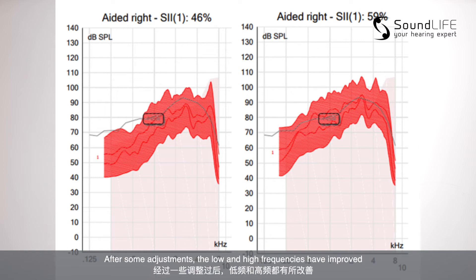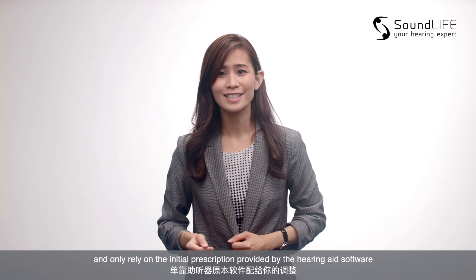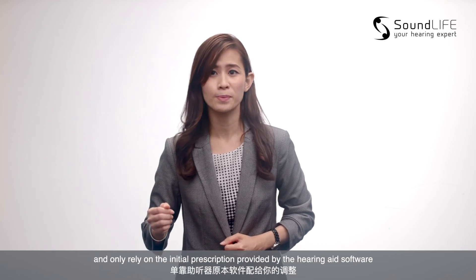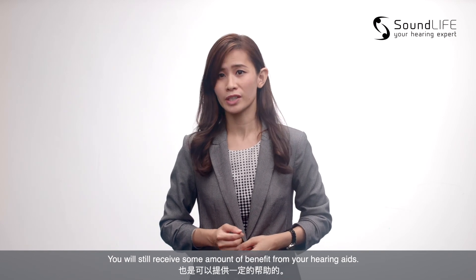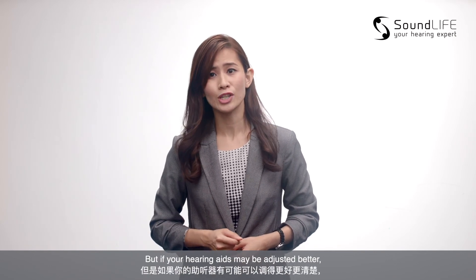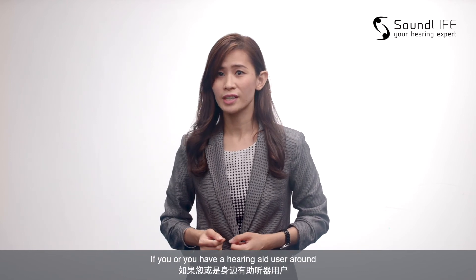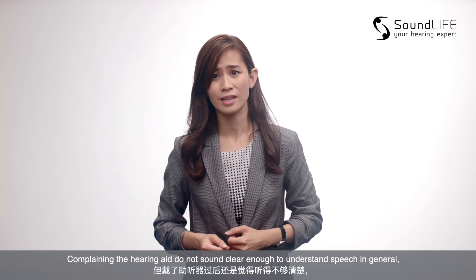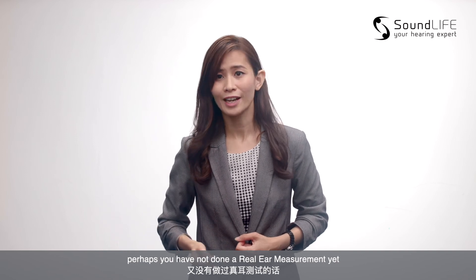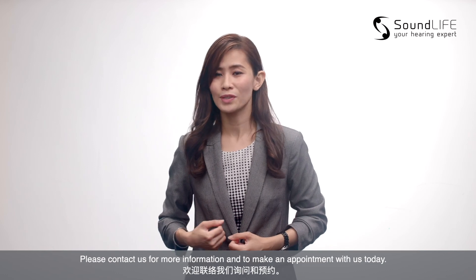After some adjustment, the low and high frequency have improved and have reached the prescriptive target better than before. Of course, if you have not done the real ear measurement and only rely on the initial prescription provided by the hearing aid software, you will still receive some amount of benefit from your hearing aids. But if your hearing aids may be adjusted better, then why should you miss this opportunity? If you or someone around you is a hearing aid user complaining that the hearing aids don't sound clear enough to understand speech in general, perhaps you have not done the REM test yet. Please contact us for more information and make an appointment with us today.